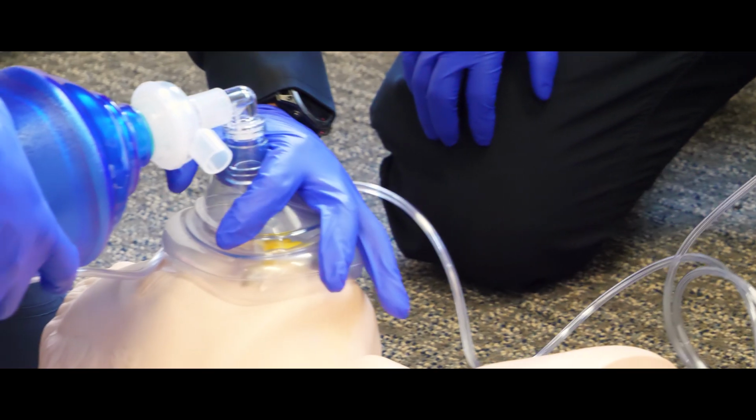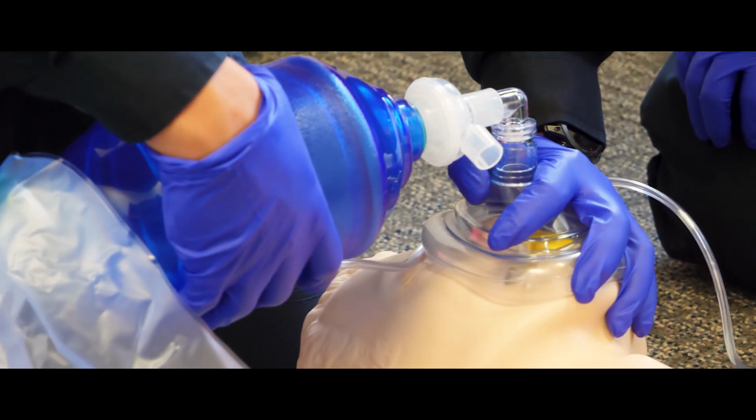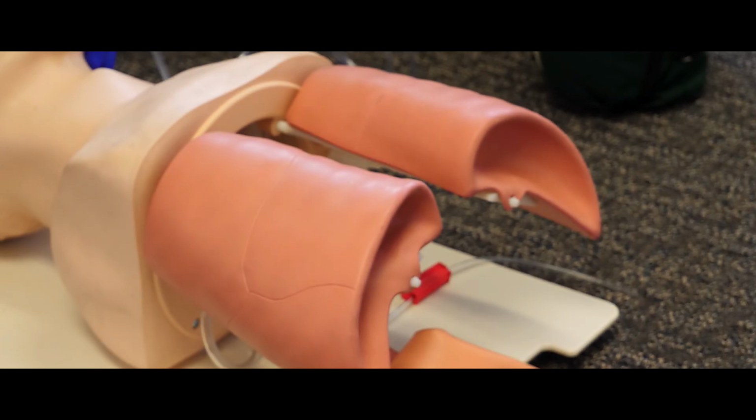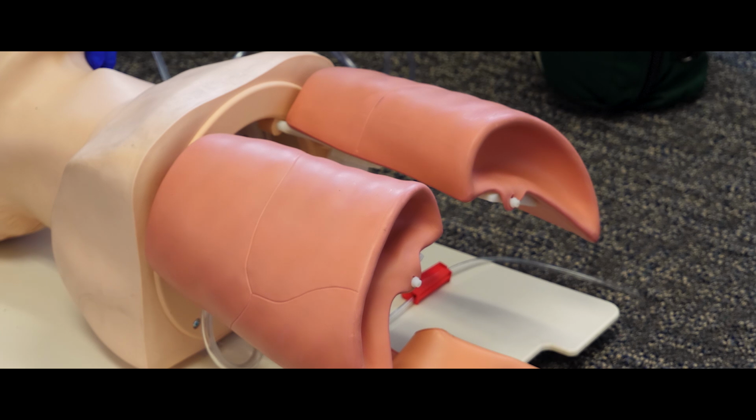The ventilation should be delivered every 5 to 6 seconds, watching for chest rise with each ventilation. The goal of the ventilation is to deliver just enough air to see the chest rise and fall. The EMT will also check for a pulse every 2 minutes.